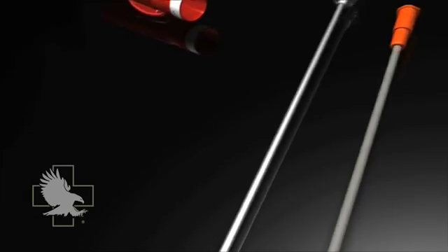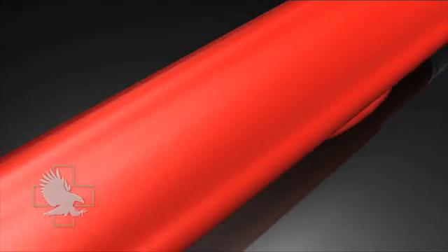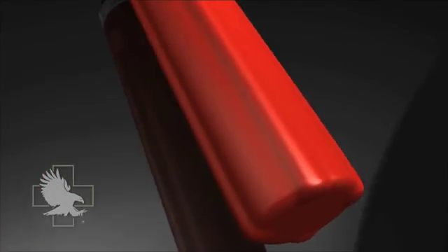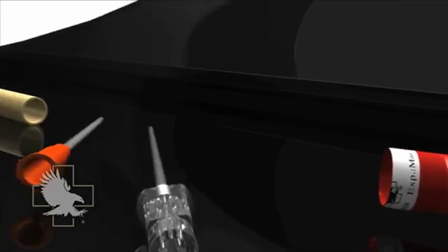The EasyGrip easy-to-open container has been designed with a red cap for enhanced identification and manipulation during stress, when a rescuer's sympathetic nervous system response limits color recognition and inhibits fine motor skills.